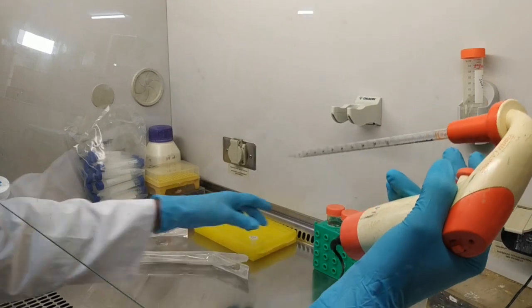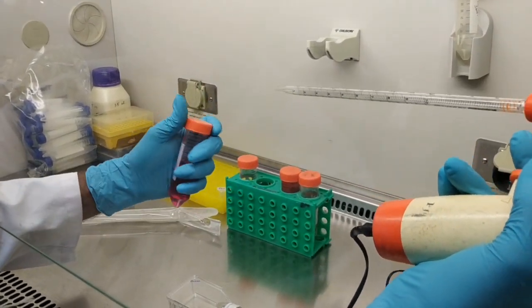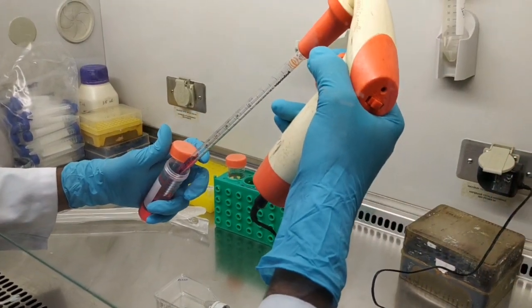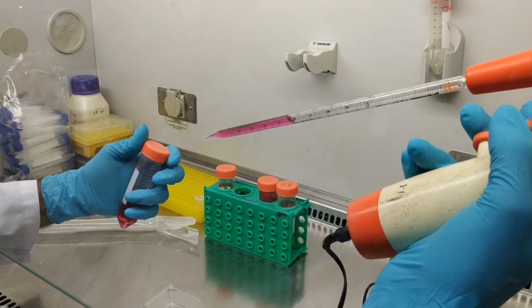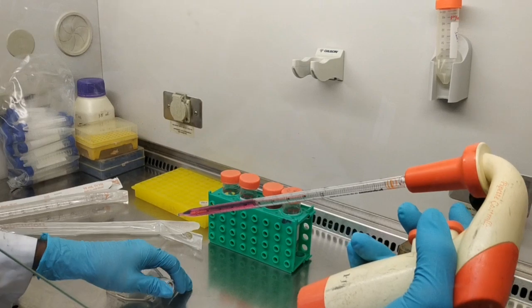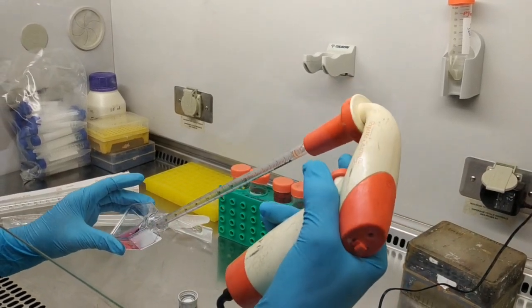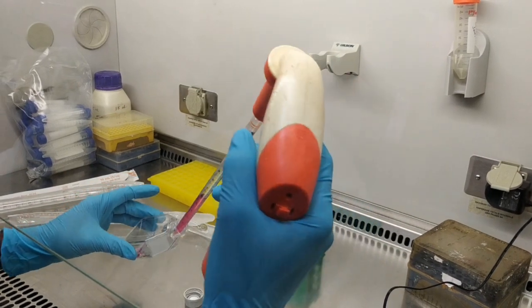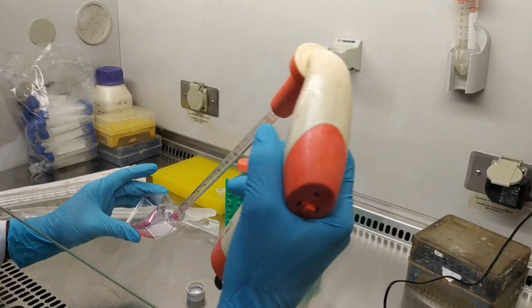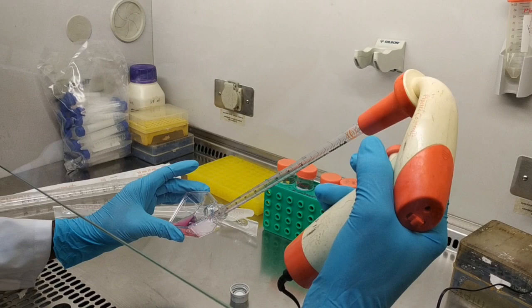Now I'm adding the medium, DMEM medium. This DMEM medium contains serum, which neutralizes the trypsin activity. Hence, there are no harmful effects of the trypsin on the cells, as there is no trypsin activity. So you can completely remove the cells, or you can collect the cells into a graduated centrifuge tube for centrifugation.